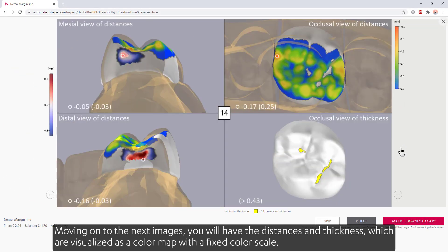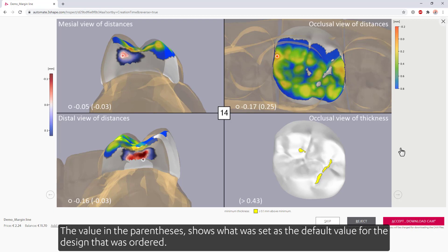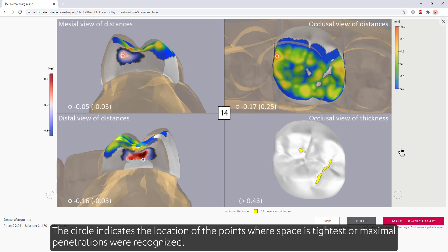Moving on to the next images, you'll have the distances and thickness, which are visualized as a color map with a fixed color scale. The value in parentheses shows what was set as the default value for the design that was ordered. The circle indicates the location of the points where space is tightest or maximal penetrations were recognized.